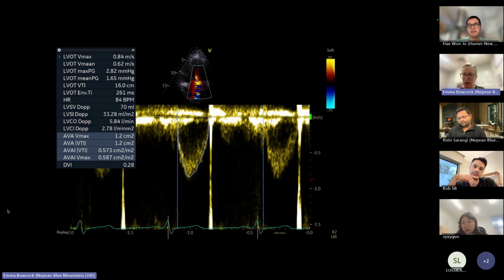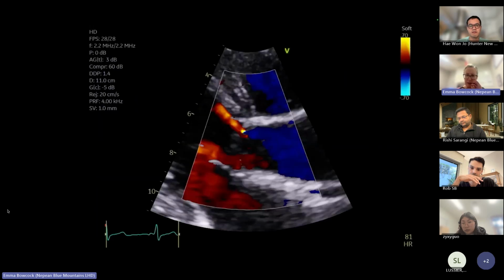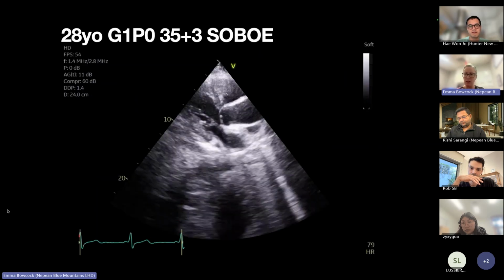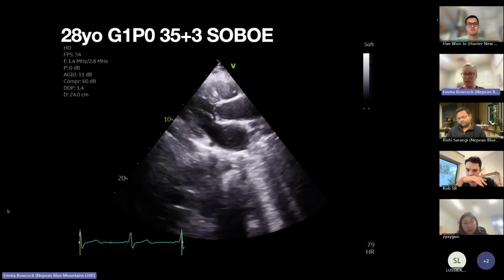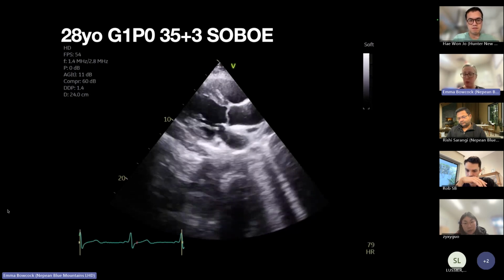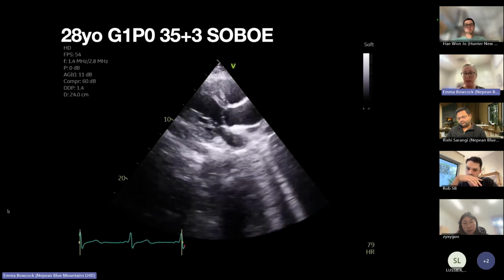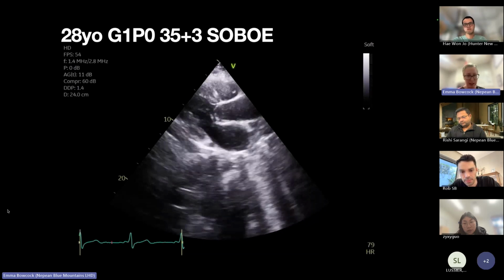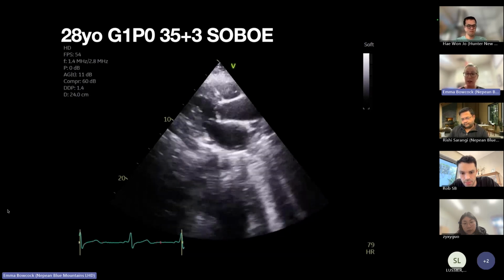Yeah, nice, Rob. I thought you were doing excellently, up until we got, so let's just go through it a little bit. I think you got everything here, and it was lovely to see that you were like, that aortic valve looks weird as hell. It could just be a really abnormal cut, but given the clinical context and the B lines everywhere and the fact that the LV looks all right, you're like, what is going on with that aortic valve?